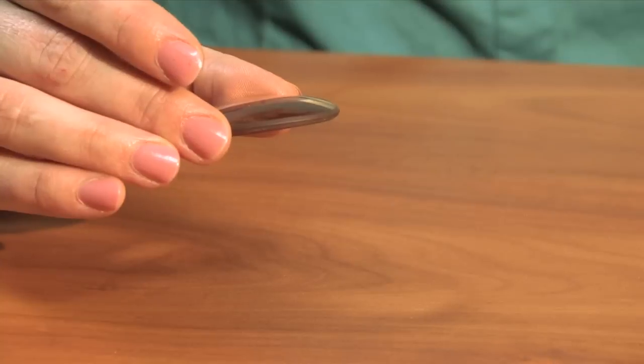First of all, the glass lens is going to feel much heavier than the polycarbonate lens. The sure way to tell is to gently drop them on the table. First you want to take them out of your eyeglasses with a screwdriver, gently drop them onto the table, and listen to the sound that it makes. A glass lens is going to make a much deeper sound than the polycarbonate lens. Here's the sound that a glass lens makes and a polycarbonate.